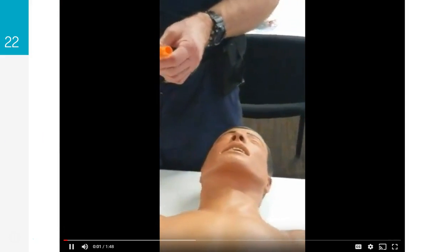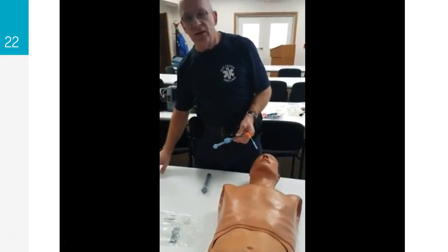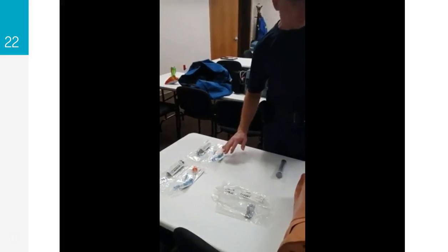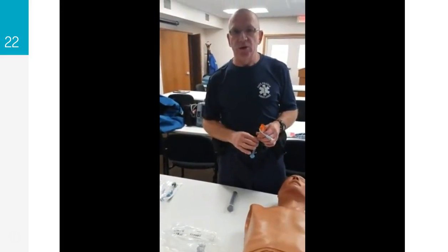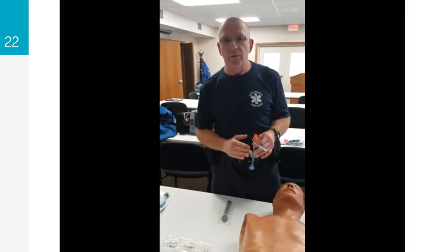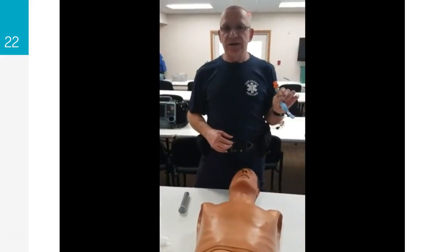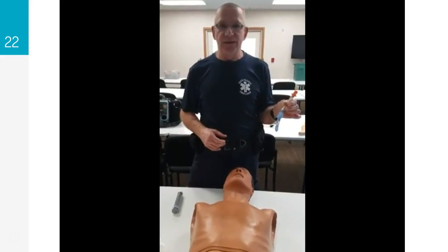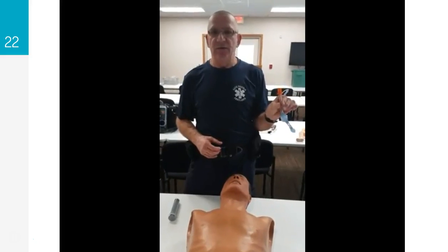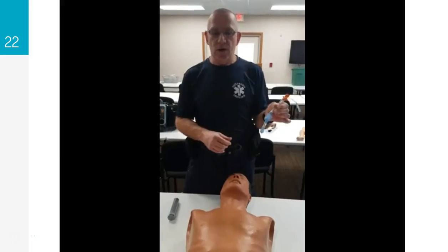We have 2 advanced airways, the King 2, which is the green model, and the King 2.5. The Pediatape will be used for measurement, so you get the accurate measurement on your patient. There is a slight overlap with the green and the orange one. Again, the process of putting in a King airway will be the same. The only difference with the King airways of this size is they do not have a suction cannulation area on them. These are too small.